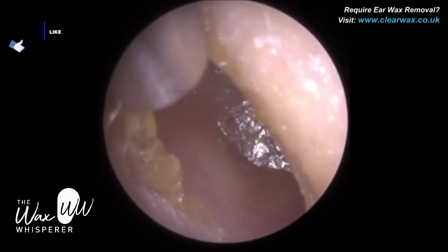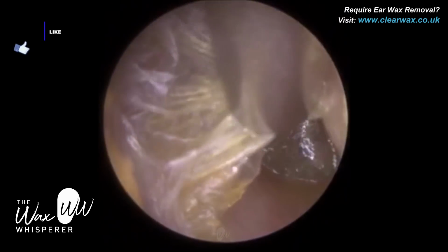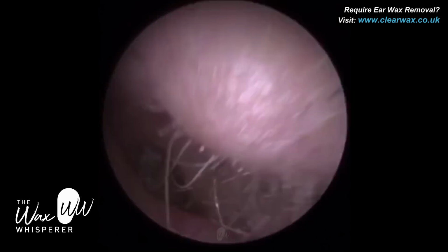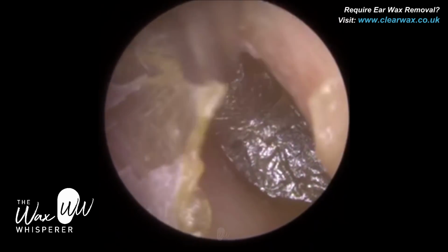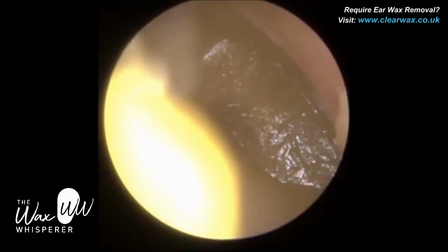So this procedure is all for the people who really enjoy skin peels. This is a patient who attends regularly to have his ears cleaned. He's got a bit of otitis externa in both ears. So otitis externa is actually an umbrella term for an infection and or inflammation of the outer ear canal.